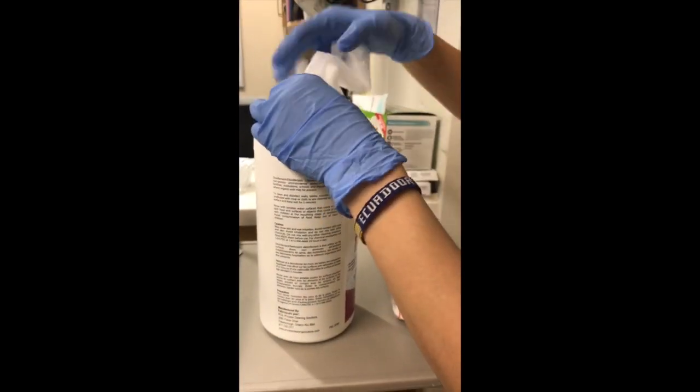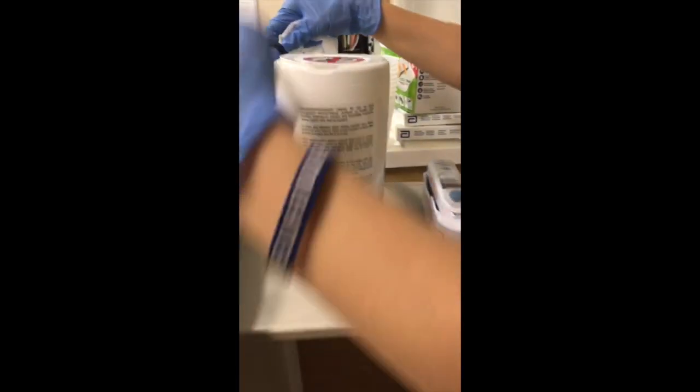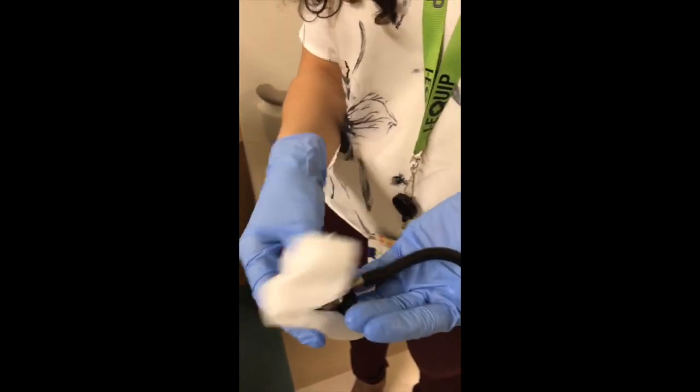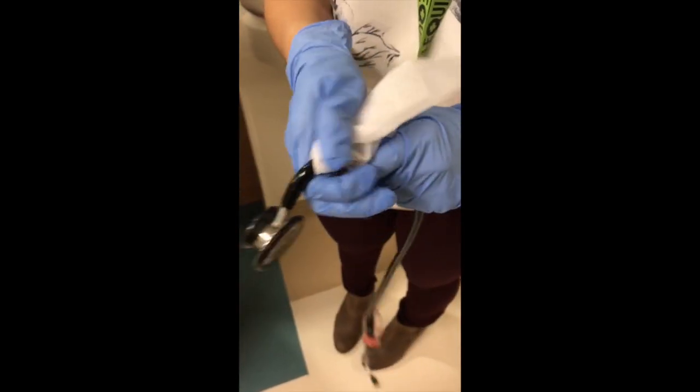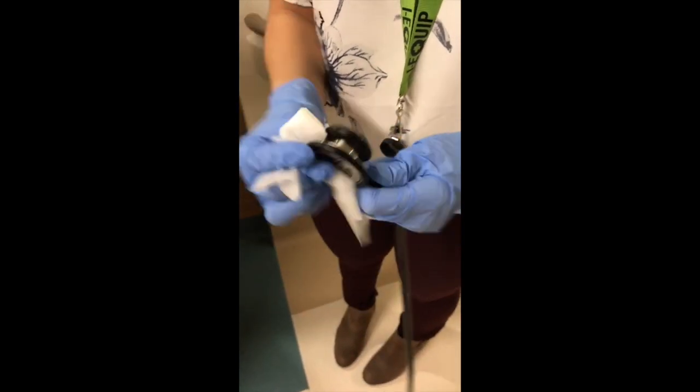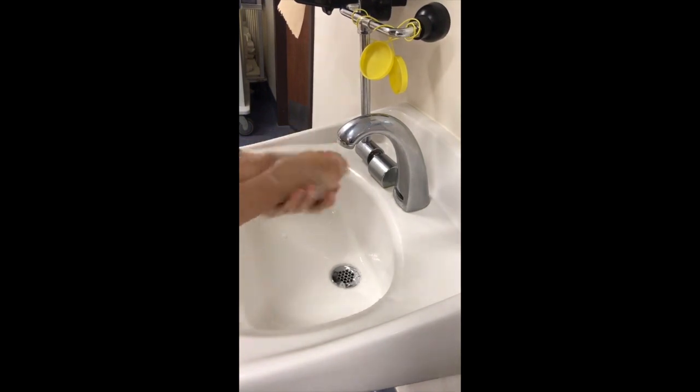After performing hand hygiene and putting on gloves, take a PCS 5000 wipe and wipe both the diaphragm and the bell of the stethoscope, being sure to apply pressure. These steps prevent cross-patient contamination from occurring in between seeing patients. When finished, be sure to dispose of gloves and perform hand hygiene.